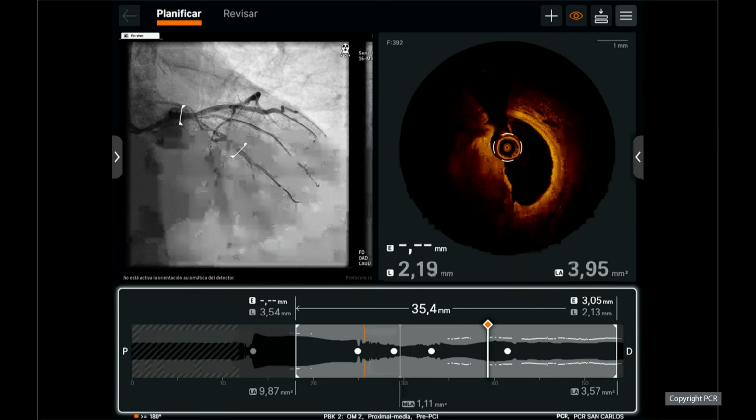So you can see this was the region where the nodule started. You can see it there. And I think you can appreciate there is actually some disruption of the nodule that is visible in different places. For example, there you can see it at 9. With orbital, you don't usually see this effect of linear fractures that you see, for example, with IVL.